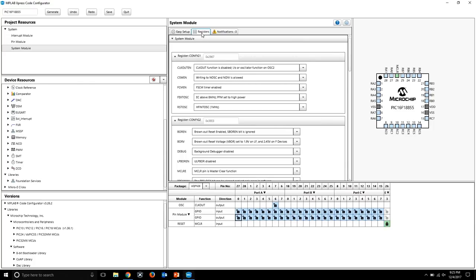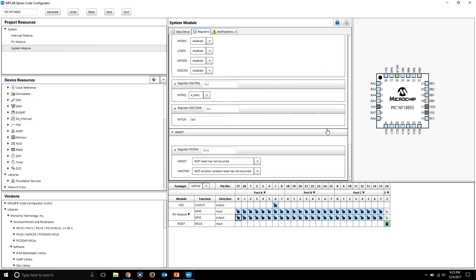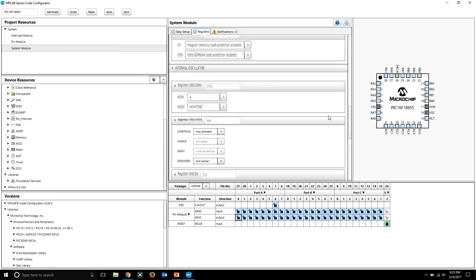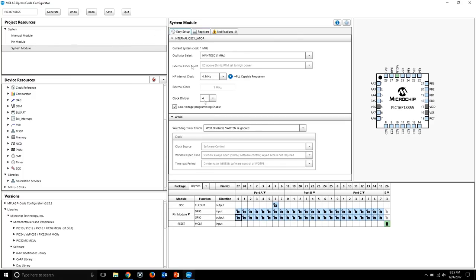And the same goes for the registers view. Once you go to the next tab, it has all the different setup for all the different configuration bits, and you can make changes right there. And if you want to know in detail what each of those means, obviously there's a data sheet. You can open the data sheet, which is the next phase, and dig a little deeper.